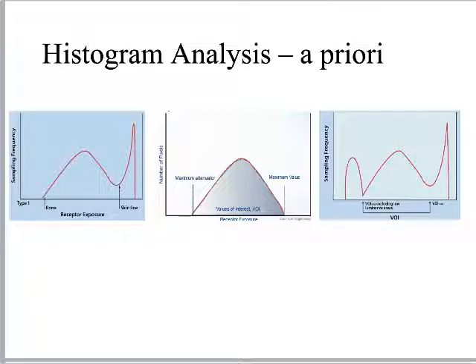We might wonder, what is that other spike there to the far right? Well, that's the stuff that's outside of the collimated field. It's that hyper-intensity of something that was exposed to the direct X-ray beam. It was not part of the person's body. It was, for example, just the empty space to their left or right-hand side on the chest X-ray, all the black here on this picture.